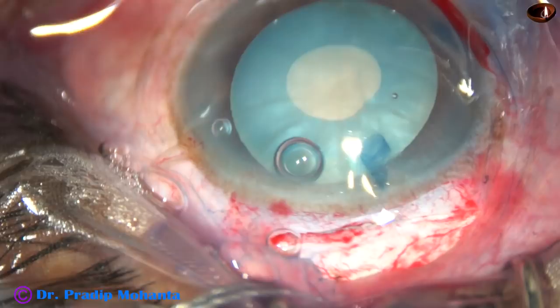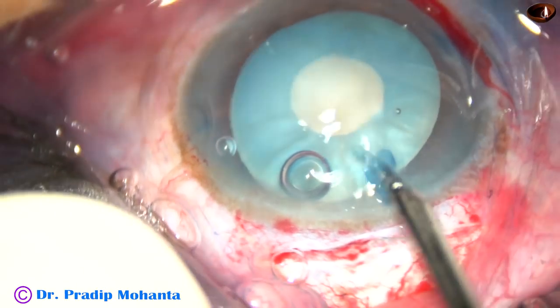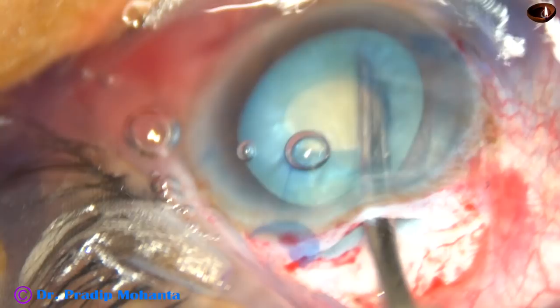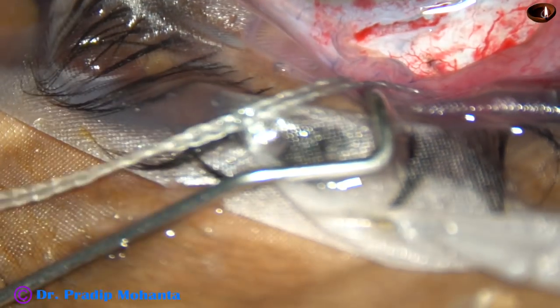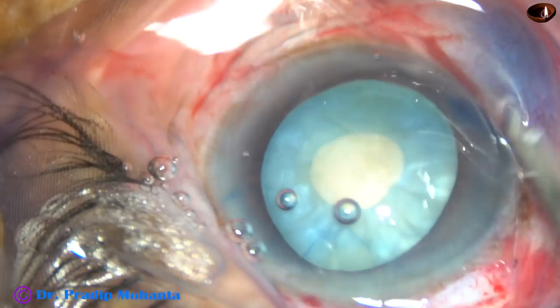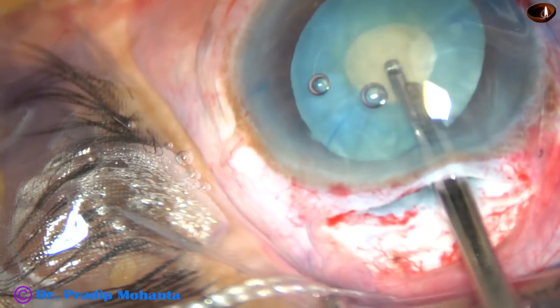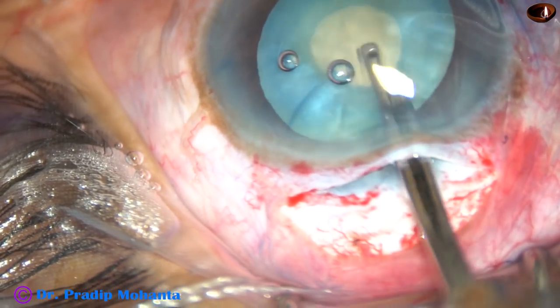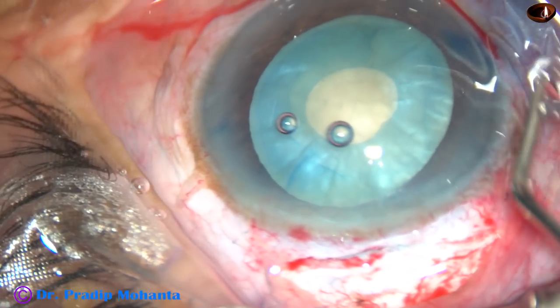Now a Simcoe cannula is used to aspirate some lens matter through this small opening — through this mini rhexis. Once the intralenticular pressure reduces, the cataract is no longer intumescent. It will behave like any other routine immature senile cataract.